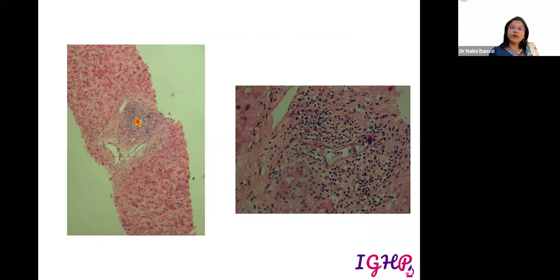Now there is another thing that we see in the bile ductal epithelium, and that is the degenerative changes. At times, the degenerative changes can be so florid that they would look as if there is some atypia going on within the bile ductal epithelium. So if you are finding abnormally dark nuclei, you should not think that these are basically dysplastic nuclei, because if the bile ducts are damaged to a greater extent, we call these degenerative changes, and these ducts look very atypical. And then if they are occurring in most of the tracts, or there is disruption of the duct lumen, then you know that these are graver forms of ductulitis, occurring as a result of this rejection infiltrate.